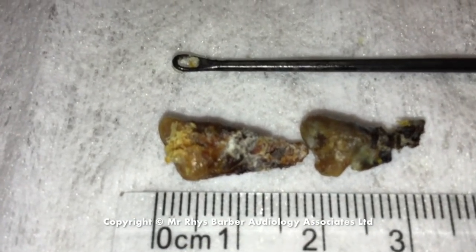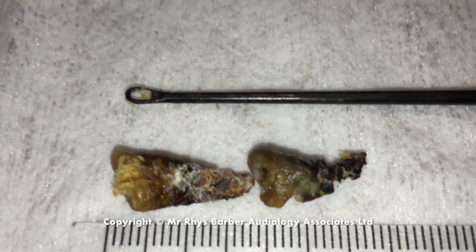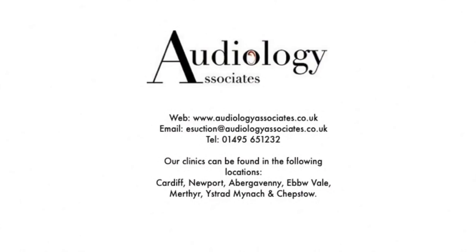Here are the two plugs we removed — the one on the left is from the second ear, and the one on the right is from the first ear, along with the Jobson horns. You can see quite large plugs from both sides. The patient felt much, much better afterwards.